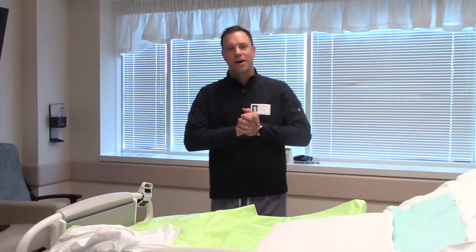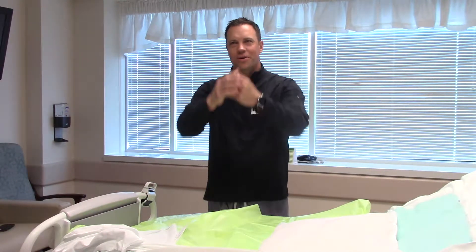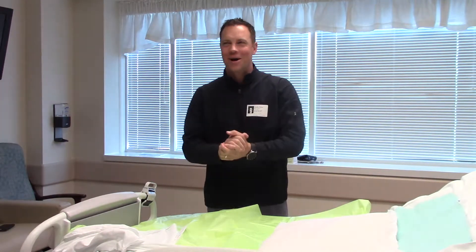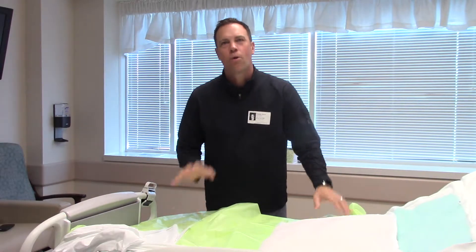Good morning everybody. I'm Tim from Stryker. I'm here with the InTouch ICU bed, and we have a good crowd built up in the room. I'm going to walk you through a couple things that you're going to have to do when you clean these beds, specifically with strapping the mattress down.